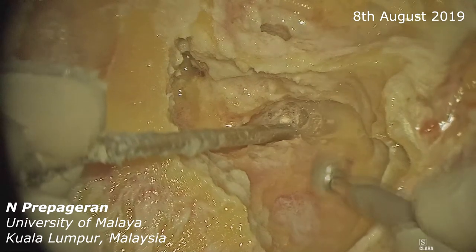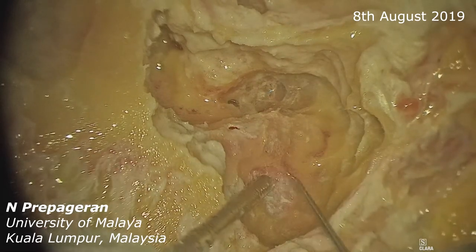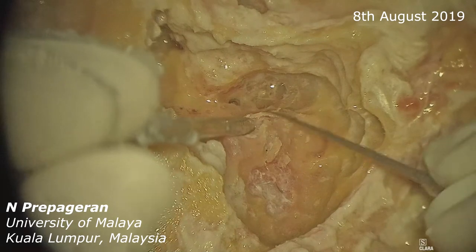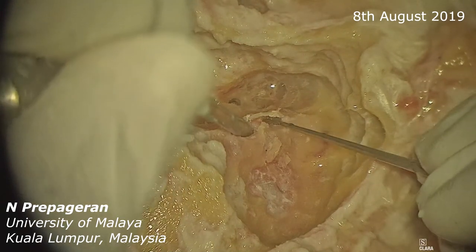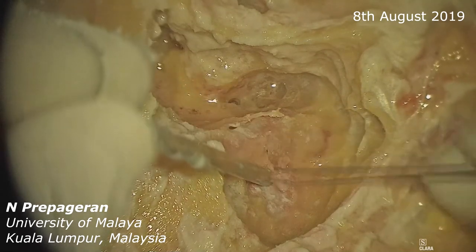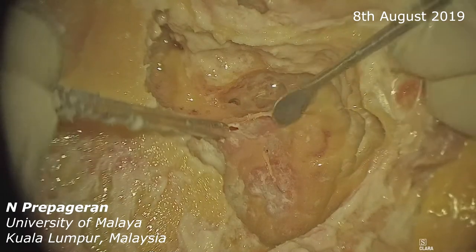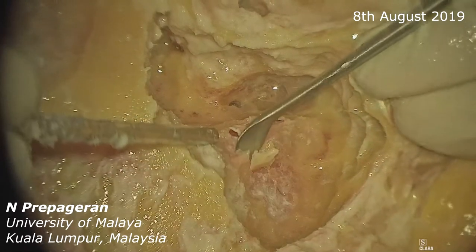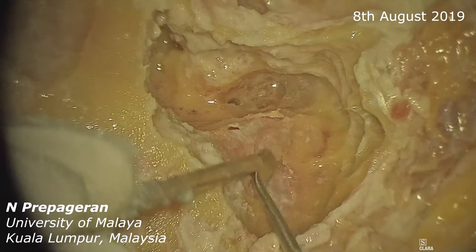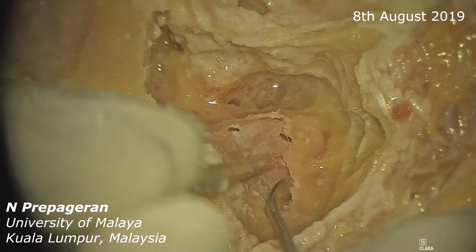The sigmoid sinus in this case is like paper. There's the sigmoid sinus there. You can actually push the sigmoid sinus down — so I'm pushing the sigmoid sinus down, as you can see. So here, let's see whether we can dissect the bone away from the sigmoid sinus. The sigmoid sinus is like paper here. Can you see how thin the sigmoid sinus is? That's very, very, very thin.